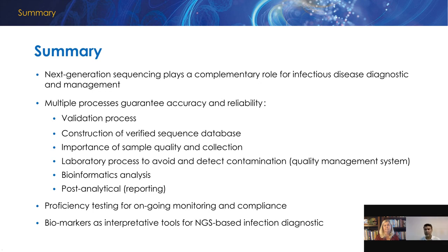Clinical presentation, possibility of biomarkers, and also quality of the samples submitted should be three variables to be used in consideration.